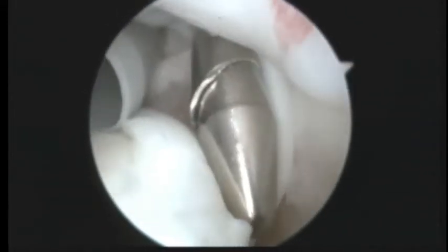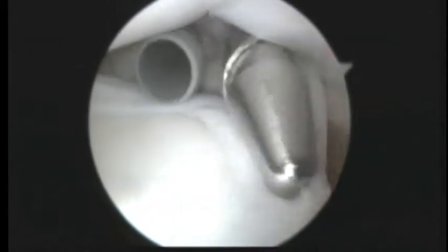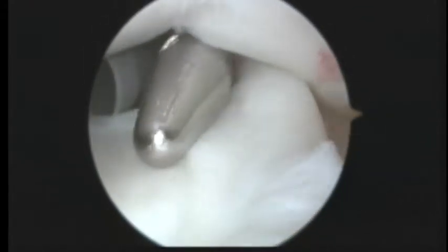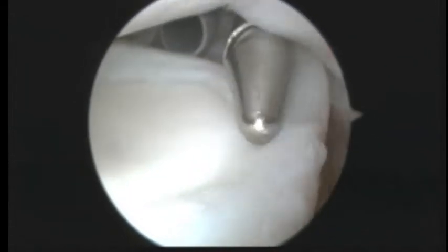And we can tug on it, it looks okay. Here's the biceps anchor at the tip of that gray cannula. And remember, that was one of the areas we were worried about. And this biceps anchor actually looks okay. As we look down at it, I'm tugging on the biceps pretty hard, and you can see it's not pulling away from the bone.